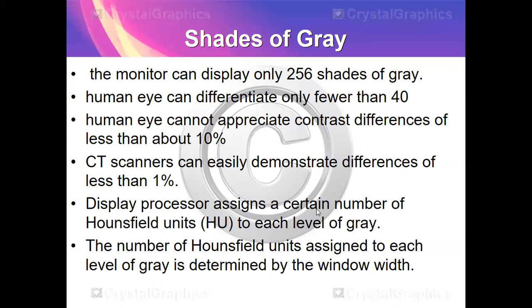So ang ating mata can only identify differences fewer than 40. So hindi aabot ng 50 shades of gray ma-identify ng mata natin. But the computer monitor can display up to 256 shades of gray. So human eye cannot appreciate contrast difference of less than about 10%.